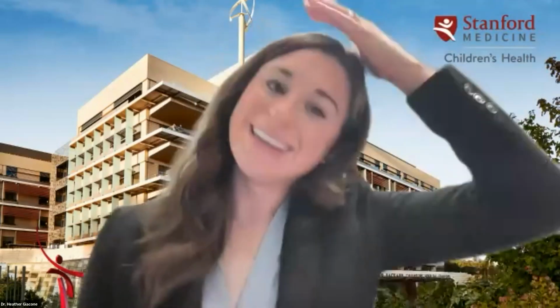And then it's really the few weeks afterwards, there's a little bit different activities that you can do with different ICDs. So for the transvenous one, because it is higher on the chest, we really talk a lot about not lifting your arm fully over your head for at least about 6 weeks or so. Although you can have mobility of your arm, we will put you in a sling to remind your body for that first few days not to lift your arm over your head or do big motions. And really, again, that's just to protect the healing up here.